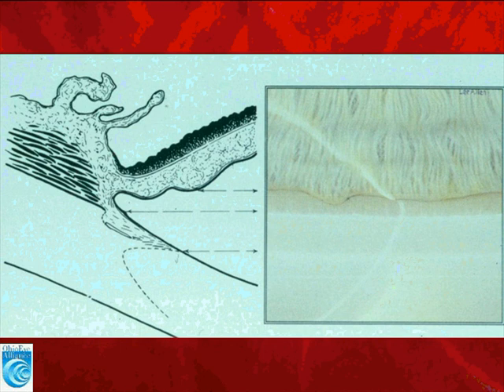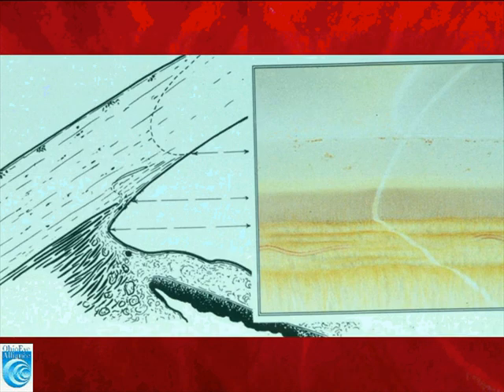In the image on the right, you can see a whitish band where scleral spur is represented. We know that this is scleral spur and not Schwalbe's line because of the corneal wedge. The corneal wedge most inferior in the picture depicts the Schwalbe's line junction, and the next line posterior to that is scleral spur. Here's a case where scleral spur appears to be somewhat yellowish and a little more broad.